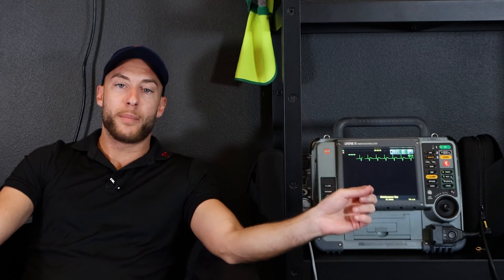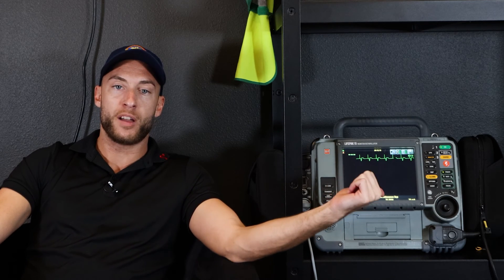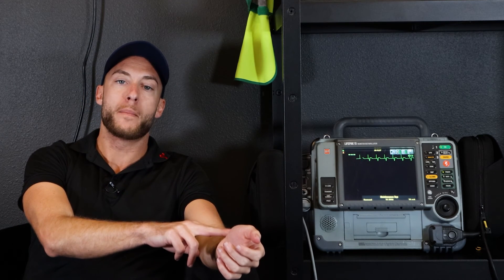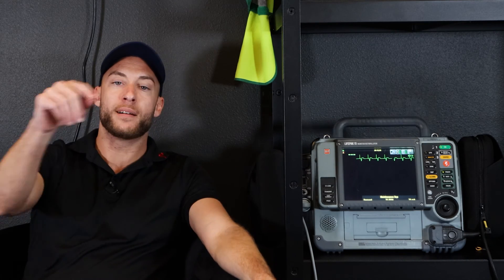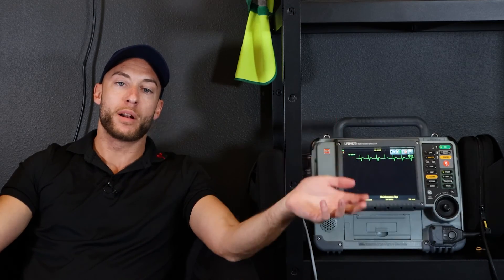We've got one more step — this is called electrical capture. I can see the pacemaking function on the LifePak. Mechanical capture: I have to get a pulse from my patient, and I want to make sure that pulse matches what I'm seeing here on the EKG. And that's what you do with an unstable bradycardia.